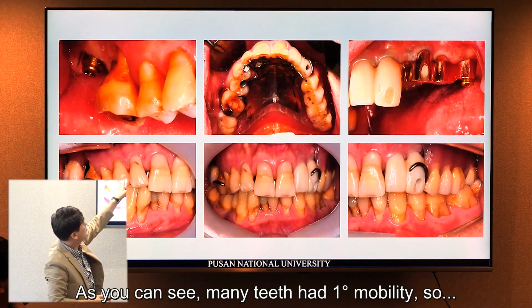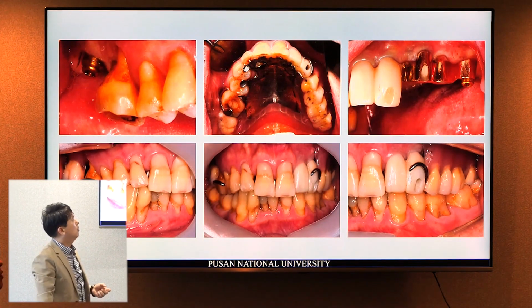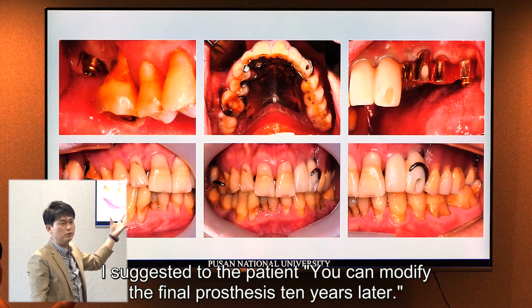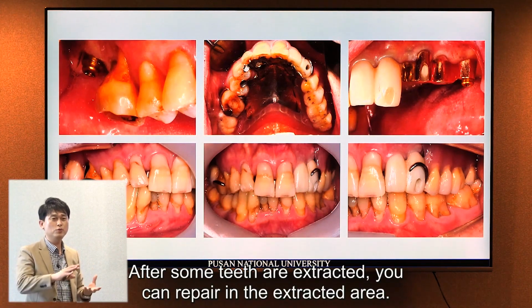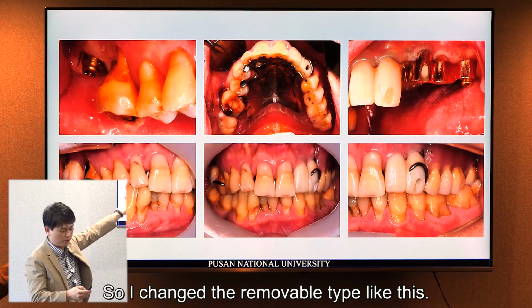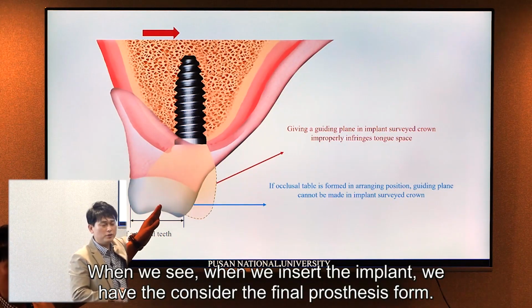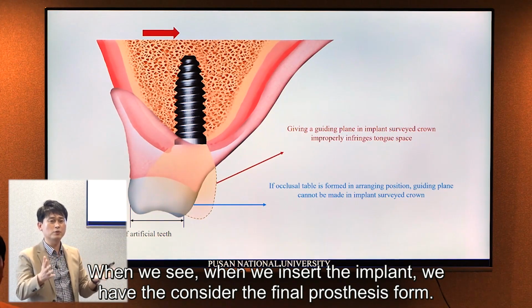As you can see, many teeth have 1 degree mobility. So I suggested to the patient, you can modify the final prosthesis 10 years later. After some teeth are extracted, you can repair the extracted area. So I changed to the removable type like this. So as I told you, when we insert implants, we have to consider the final prosthesis form.